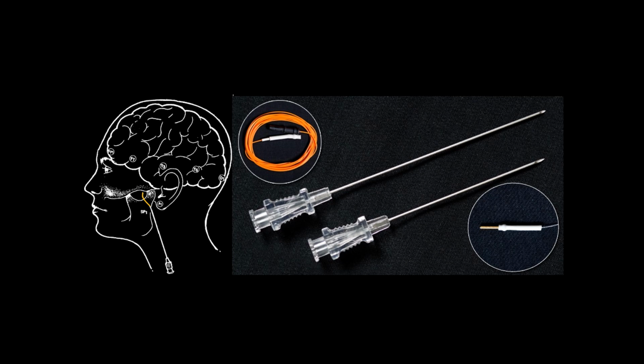I doubt very much that you would ever use a sphenoidal EEG electrode, so I will not explain its insertion. In the past, I have placed a few of them. Overall, I think patients tolerate having the procedure done better than I tolerate doing it. But still, not much was ever gained from doing them.